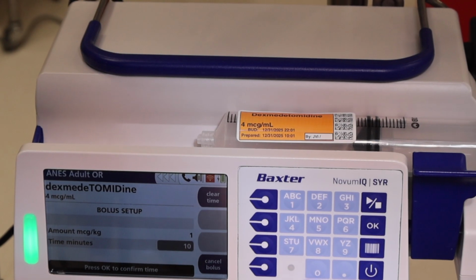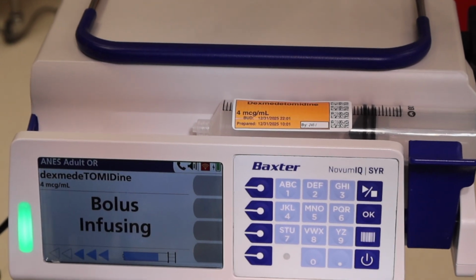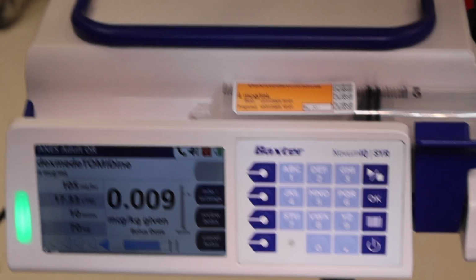At approximately 12 minutes before intubation, begin the dexmedetomidine bolus, 1 microgram per kilogram over 10 minutes. Starting early allows the infusion to complete before you insert the scope, giving time for sedation to reach a steady state.